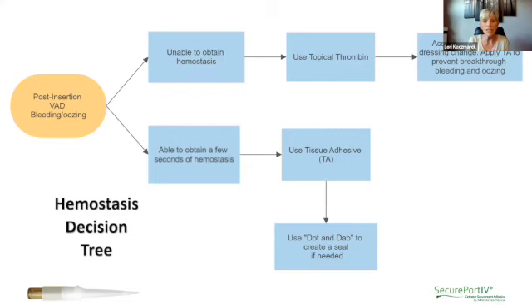So while it's not going to be something you can use on that really aggressively bleeding catheter, where you can't get anything clean and dry for a few seconds, it is an opportunity. And some of these larger catheters, we talk about drop, not a lot. So we're cautious about putting less on those types of catheters.